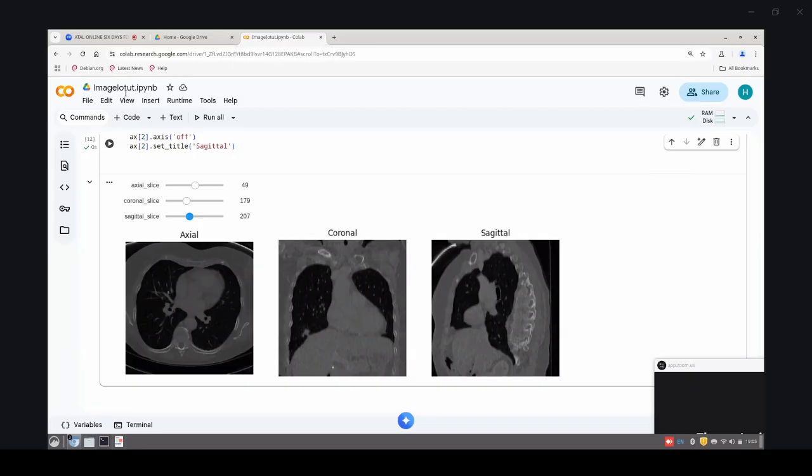And you can use the imageio library or the PyDicom library. Generally, the images will be stored in DICOM format in any hospital X-ray machine output. You will also get JPEG or PNG images nowadays, with digital X-ray in a lot of facilities, where software has come up so that the X-ray image can be exported as JPEG and PNG images. But ideally, for all medical image communications, the recommended world standard for any hospital information system is the DICOM format.